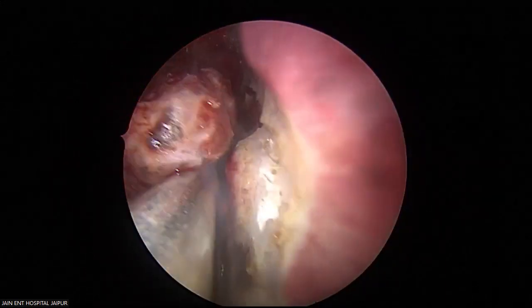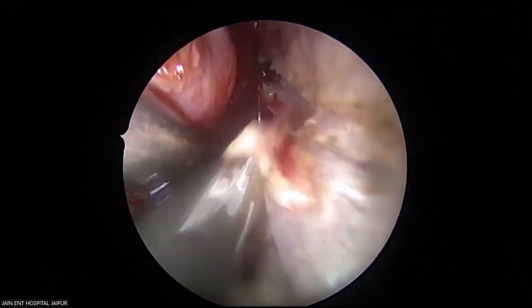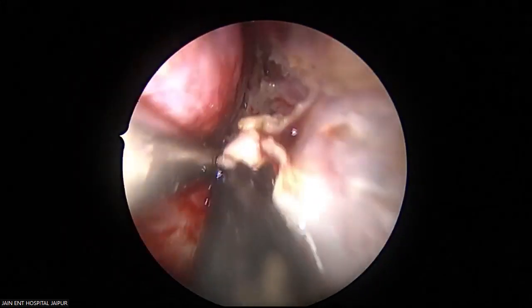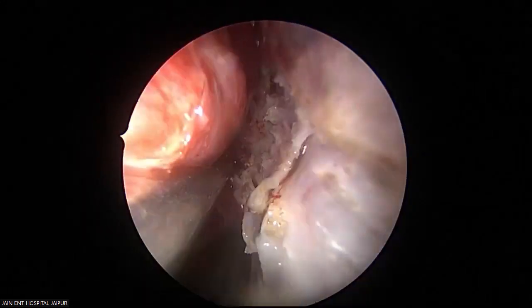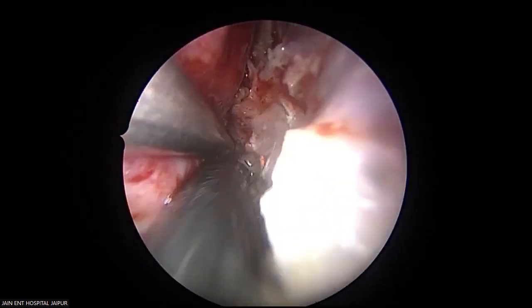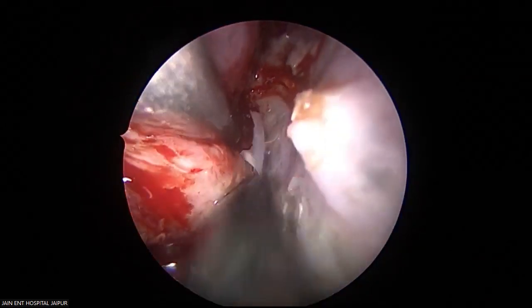I am removing this posterior most part of the septum to go medial to and behind this tumor. This septal mucoperiosteum I am removing, till the posterior edge, you can see.